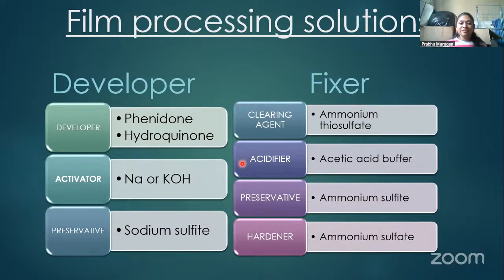And you all know, right? After fixing, most of your aprons will be brown in color because of that acid only. What is happening is it is going to cause pigmentation in your clothes. So that is a very dangerous chemical. Okay, most of our first year aprons have been wasted because of the solution only. So the developer solution is slightly alkaline in nature, and the fixer solution is acidic in nature. It is a practical point for you. Okay, so the developer solution: after you immerse the X-ray into that, it becomes completely dark or black in color because it is completely developed.